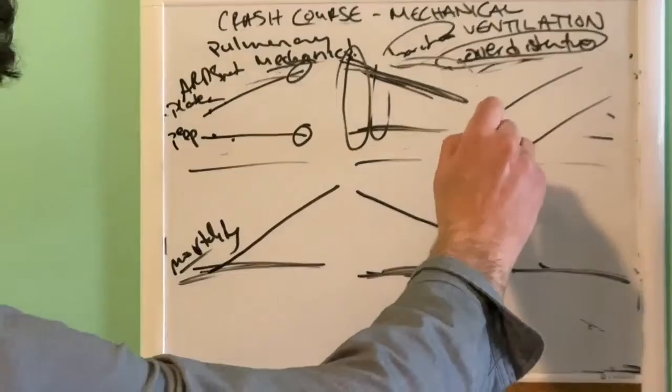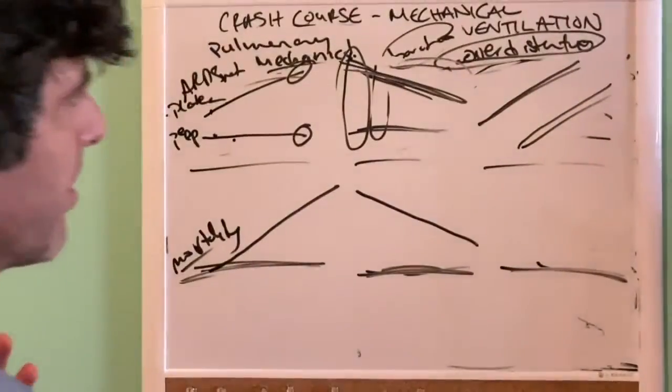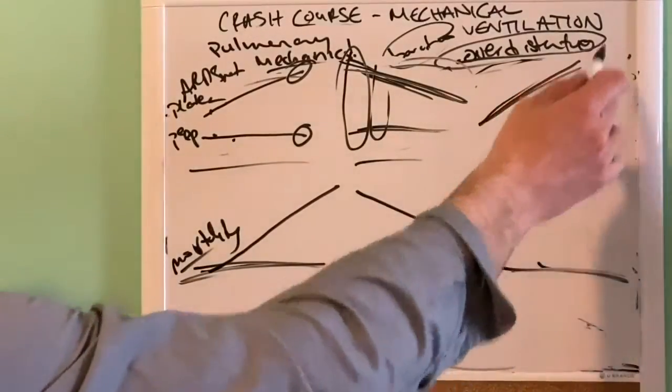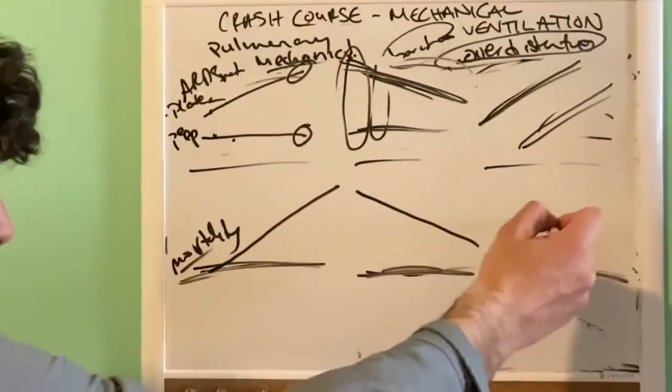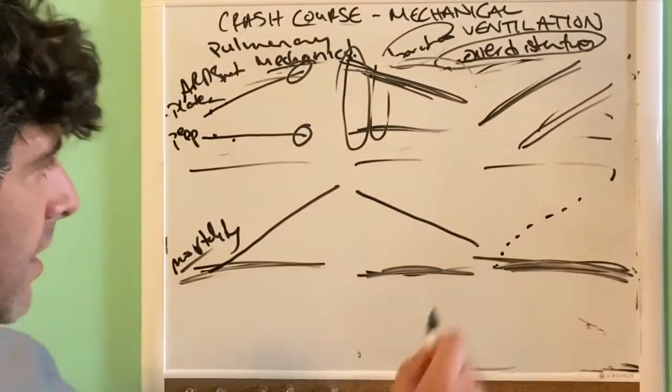But now let's think of this, and just try to think of what you would necessarily expect a patient to have. The PEEP's going up and the plateau pressure's going up. I think a lot of people would expect the mortality would go up, and really they found that it was steady.